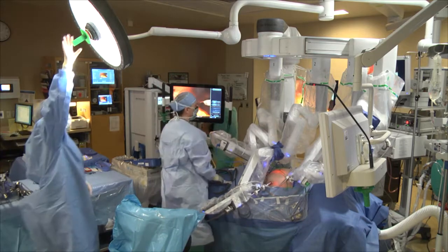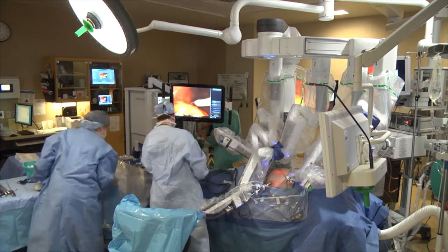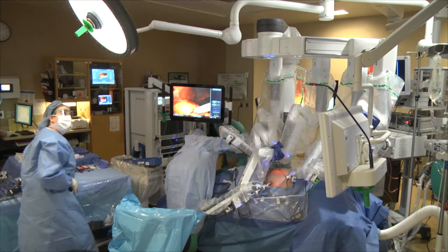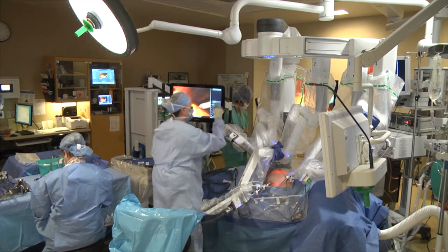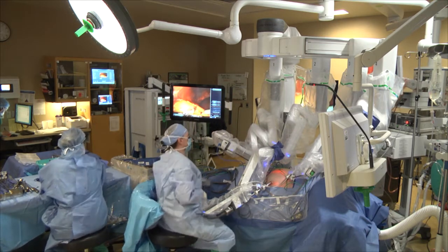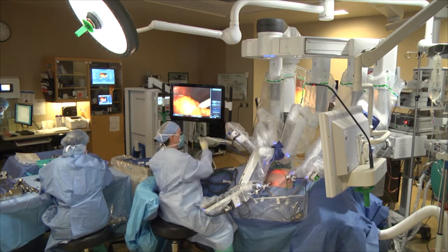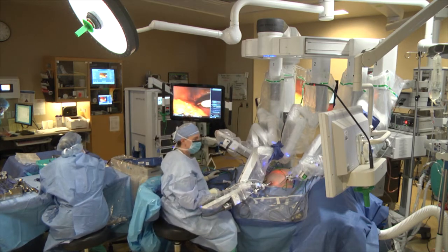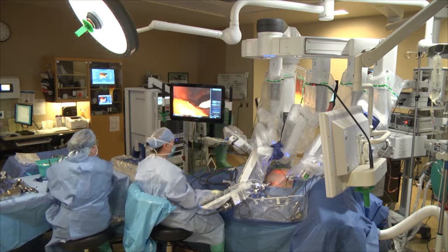The other option would be to actually dissect out each of those vessels and then do a selective clamp, but this guy is a healthy guy with normal renal function, normal contralateral kidney. Selective artery clamping in his case would be purely elective and probably overkill, wouldn't make a difference to his long-term outcome. So I'm planning to do a main artery clamp, basically. Any objections from the panel? No, it seems that would be reasonable. Absolutely. So we're going to go back to the operating room view. Okay. All right. We can see you now.